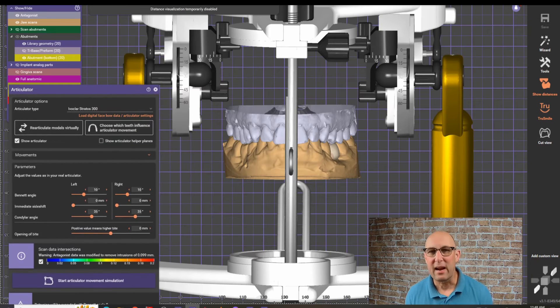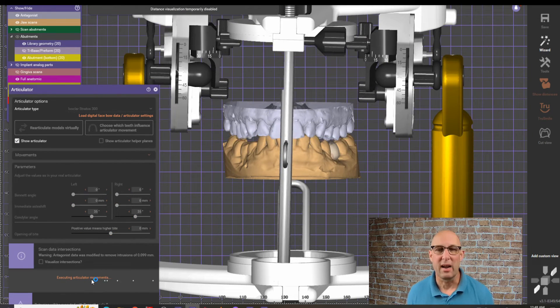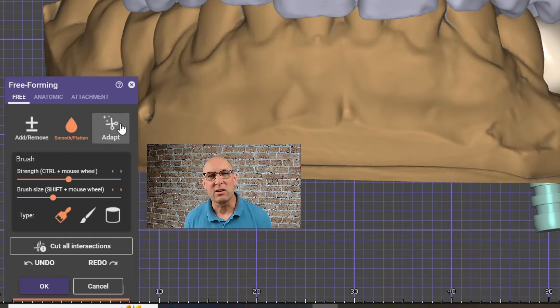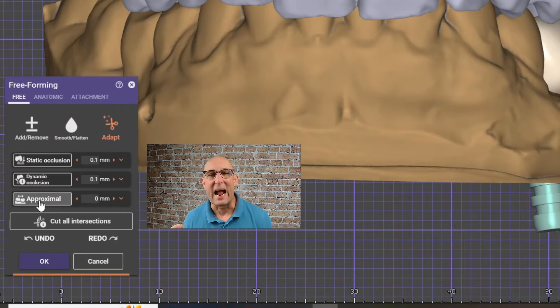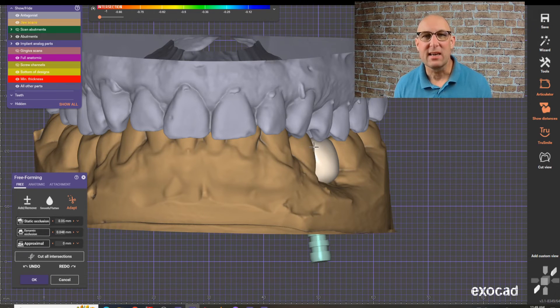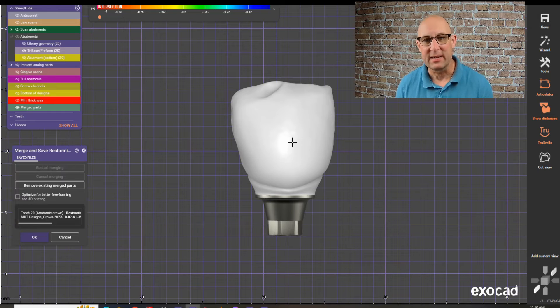Then we can add an articulator function — we can align it, record the articulator movements, adapt it, and apply it to the occlusion under dynamic occlusion. This will automatically reduce all the interferences in the crown. And that basically completes the design of the screw-retained crown on a tie base.